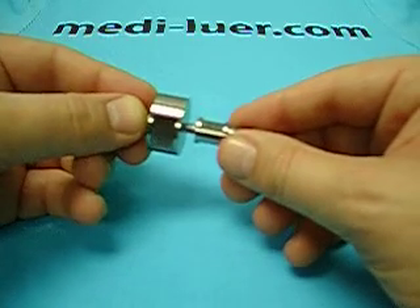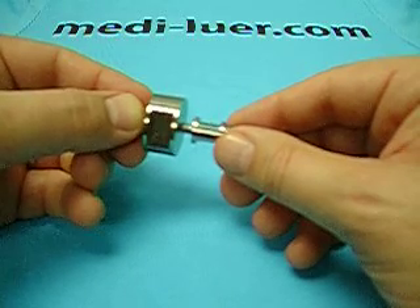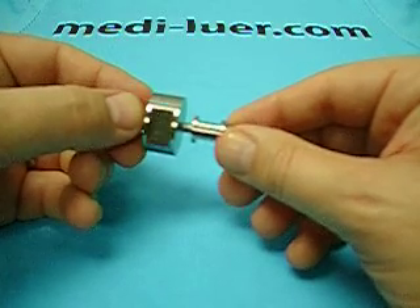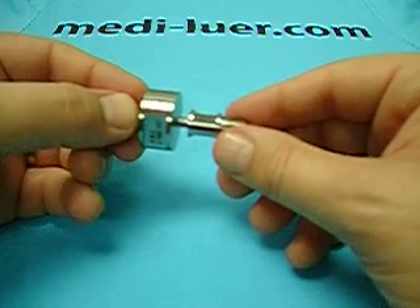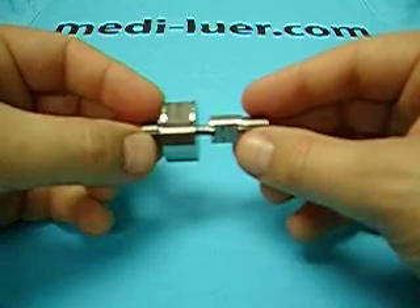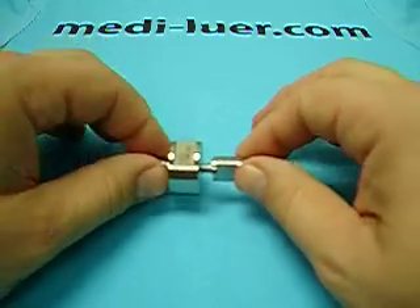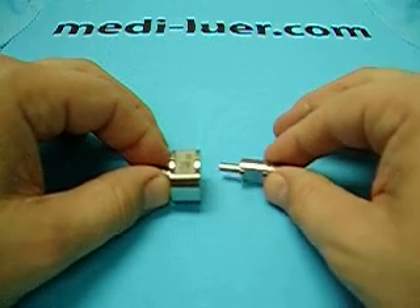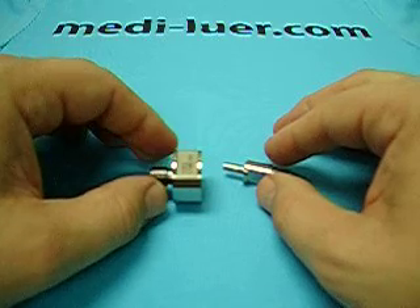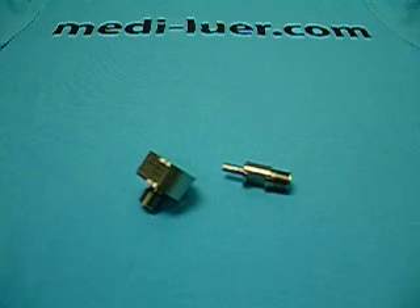If you use the machine, the machine has calibrated meters, calibrated force, and it has a degree wheel so that you will be able to assemble the fitting correctly. Once it's assembled correctly, you will be able to perform the tests required by the standard and you will be able to support those tests as valid if you are questioned by either your customer or a regulatory body. And that is how you use the ISO 594/1 figure four reference fitting.